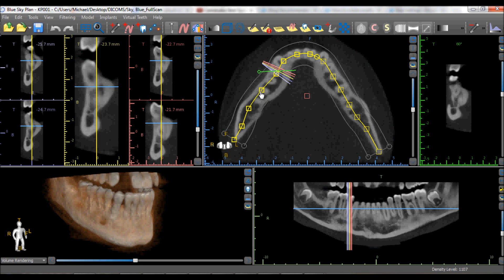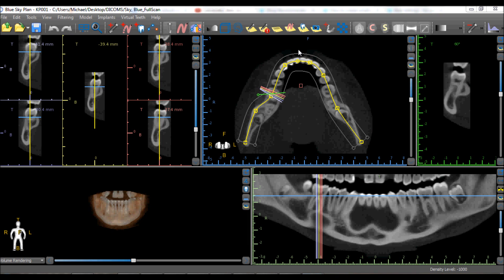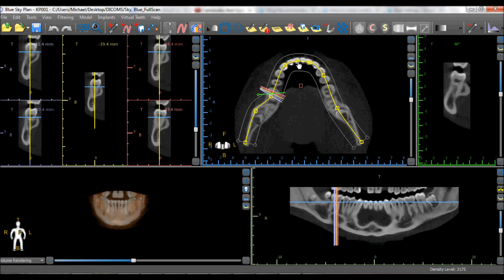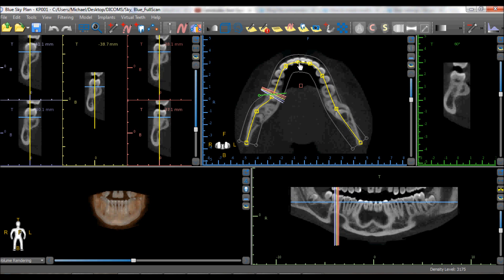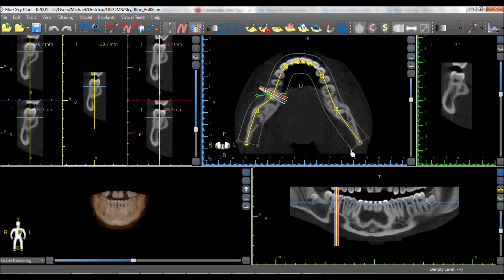Fine-tuning placement is particularly helpful when looking to accentuate the nerves in the mandible. The circle at the top of the panoramic curve can be grabbed and dragged to resize the entire panoramic curve. The circles at the ends of the panoramic curve can be dragged to resize the field of view.